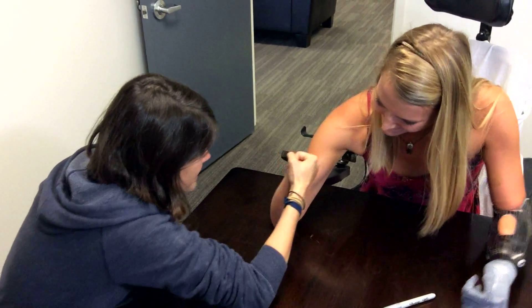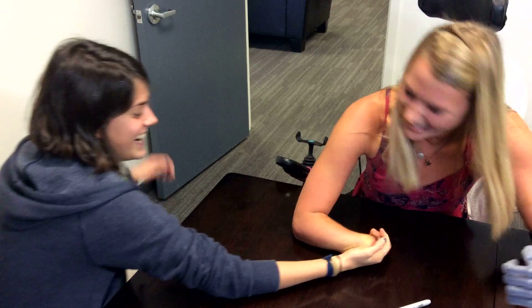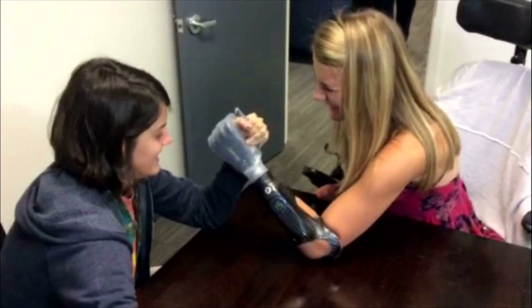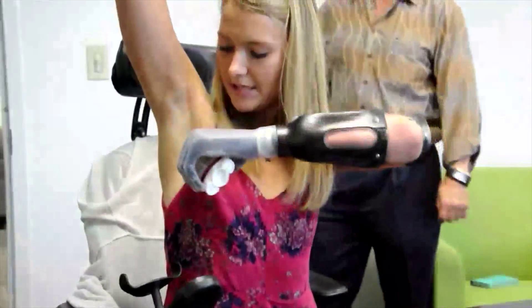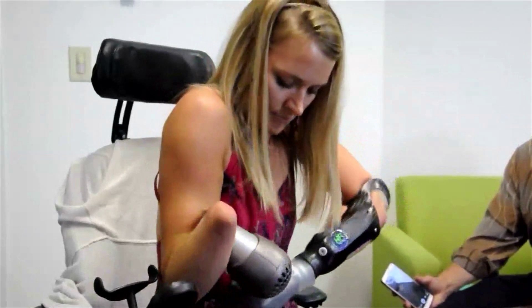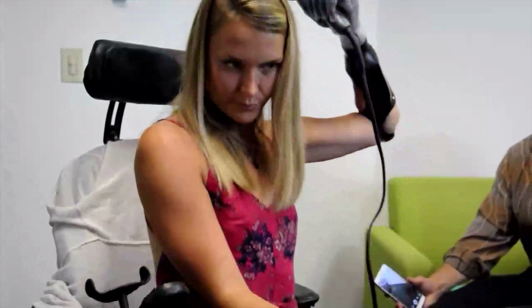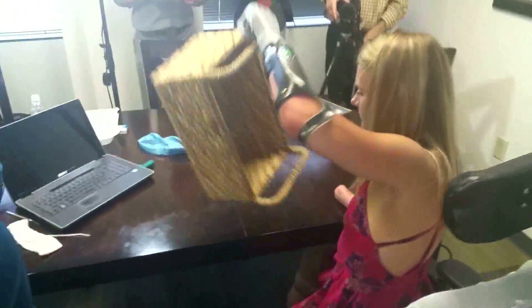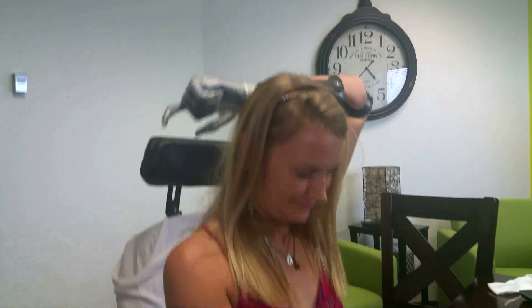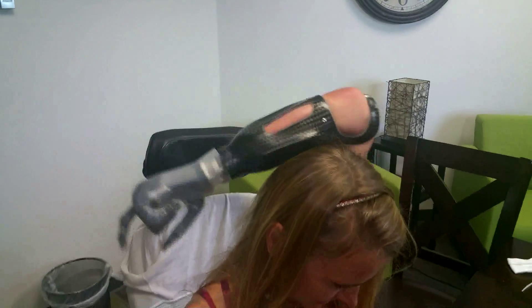Ready? One, two, three. Head down. Ready? Oh yeah. Want a good angle? Lovely, left. A little toasty up there. Back eye up. Pop it up onto the table for me. And holding it behind your head — it's staying on and doing the right thing? Oh yeah, oh my gosh, awesome. Not coming off. Not coming off. That's great.